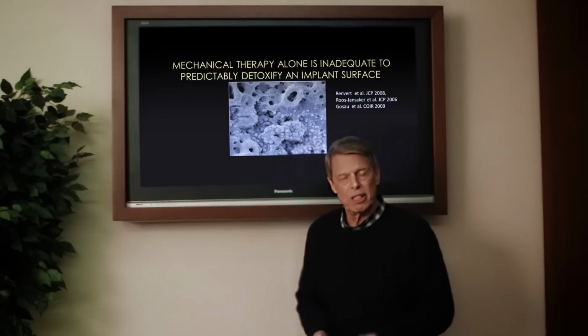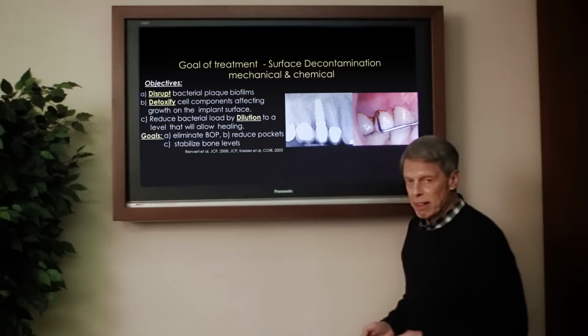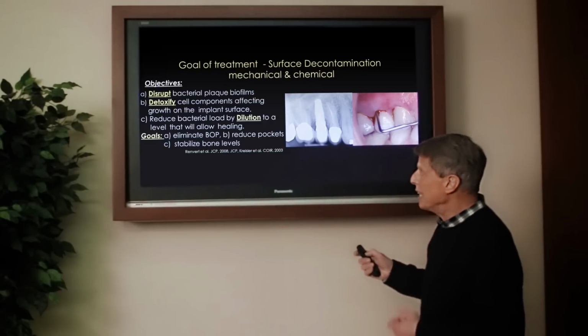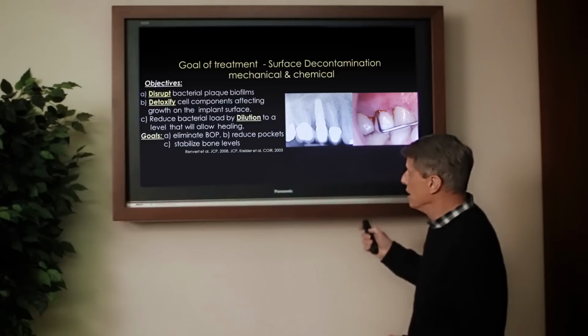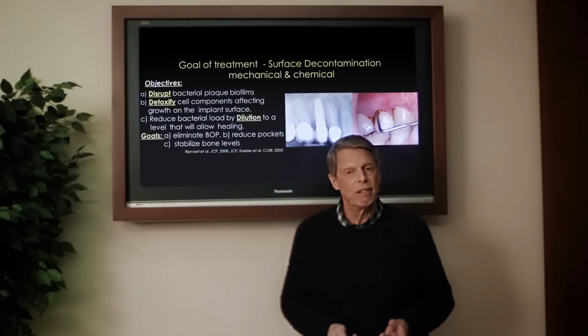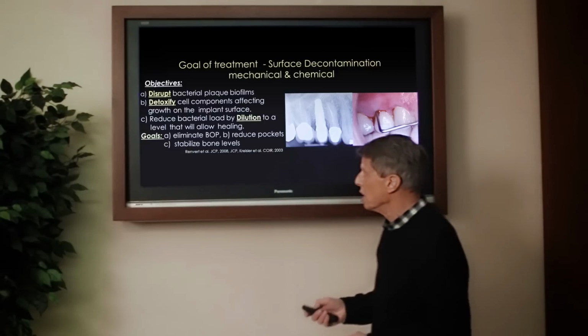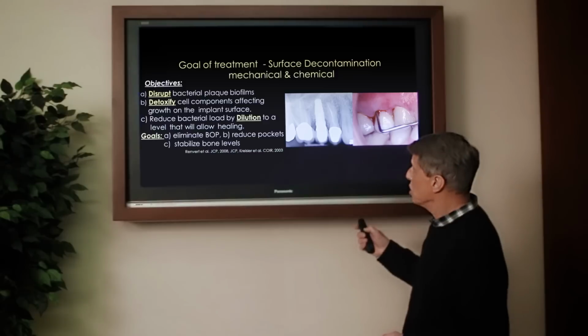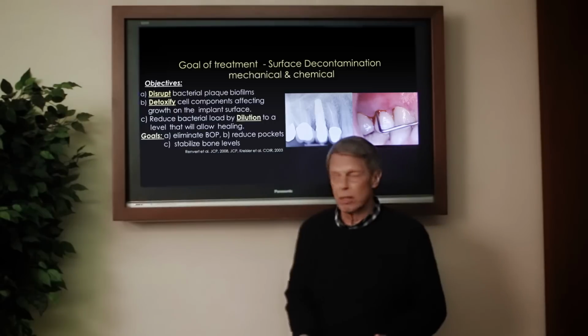That means that cleaning an implant surface is not a monotherapy, but it's a bitherapy. And besides mechanical cleaning, what we get involved in is chemical detoxification of the implant surface. So the goal of our treatment is surface decontamination, both mechanical and chemical.